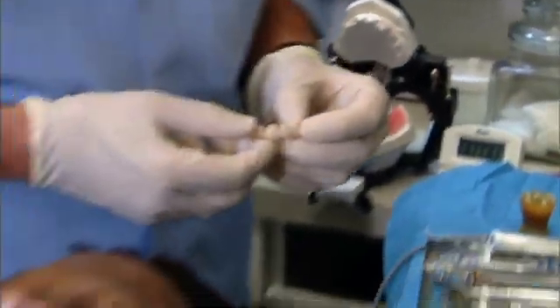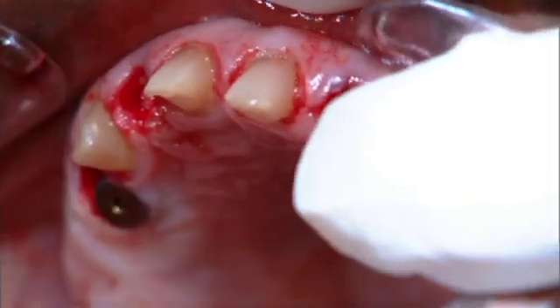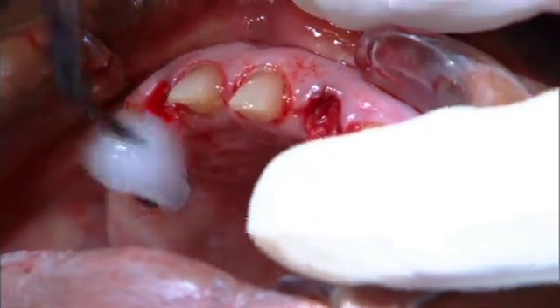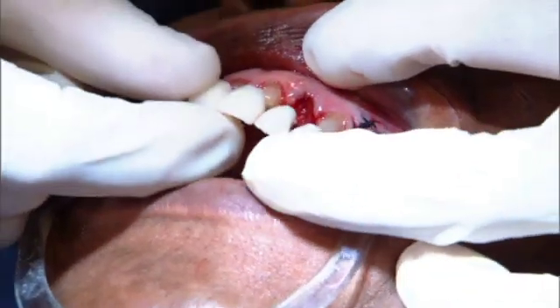And Kathy is actually lubricating the temporary partial with Vaseline so that we don't get the temporary partial and the provisional as one. Let's put just a little bit more. There you go. Thank you. Perfect. Perfect.